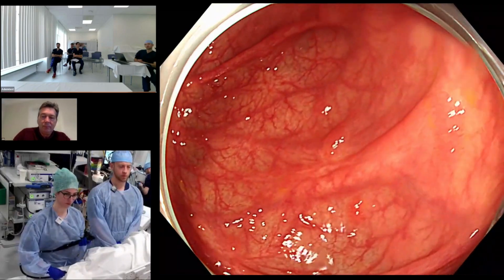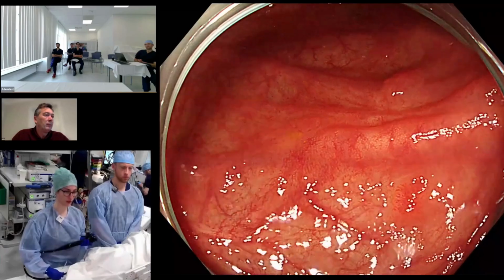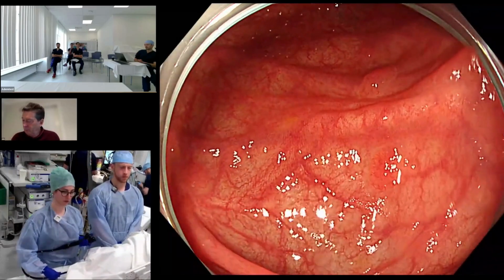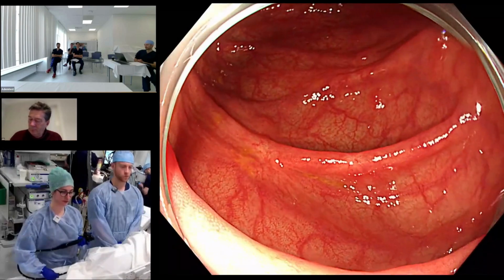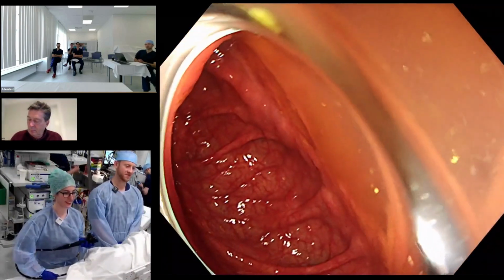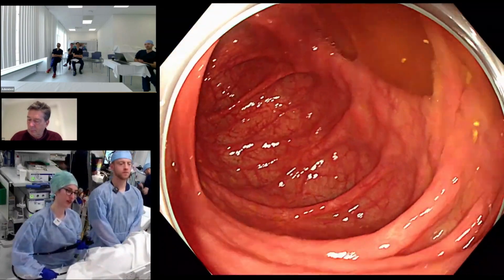CK. So I think, Maria Eva, have you done a retroflexion here? Not yet. I saw Xander doing it before, but maybe it's interesting that you now try, because it was too easy for you, this colonoscopy. I think everybody agrees that. So why don't you talk us through how you might do a right colon retroflexion, how you might manage the fluid in that situation.